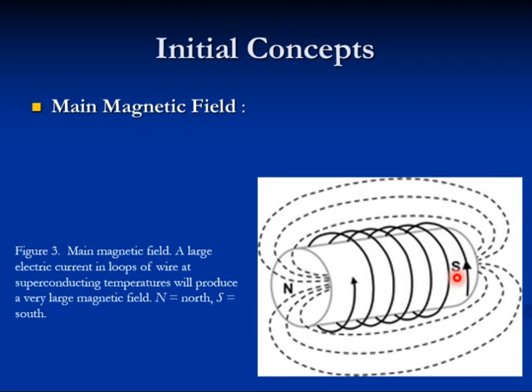Now, every one of us has hydrogen atoms. They are distributed in all directions, random. Put it in the MRI machine, it will be all in the same direction.